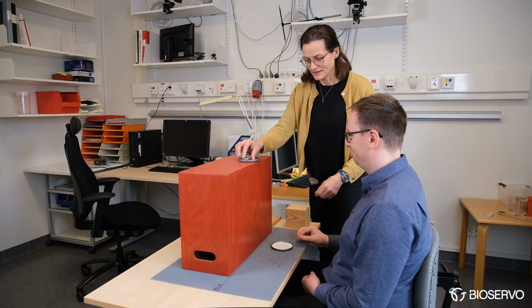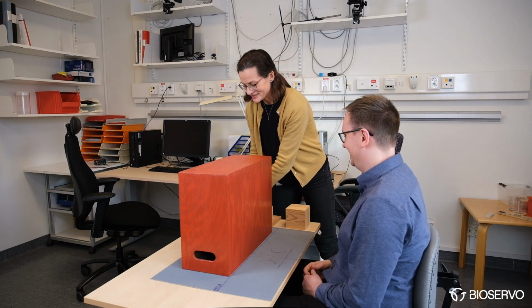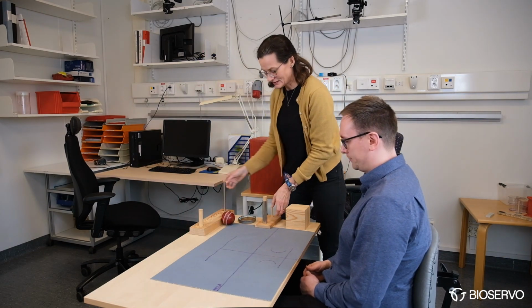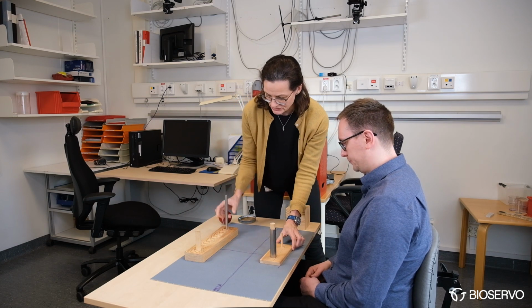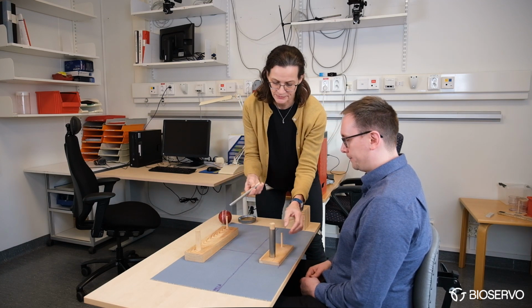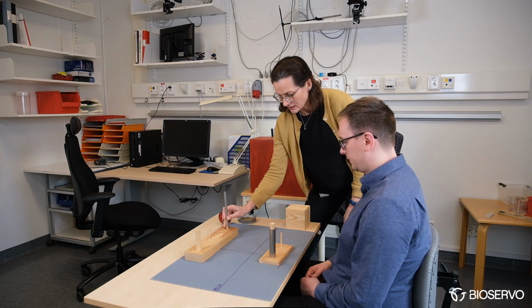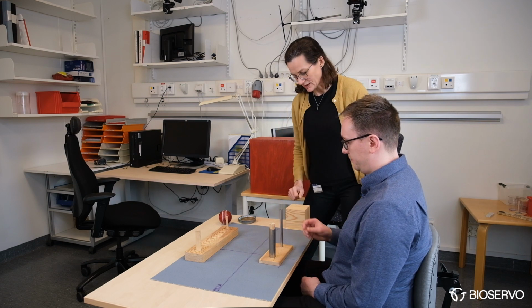And back. So in your case, everything is easy, but it's not usually so when you have difficulty to move. No, of course. And I show the other one here, for example, the different grasp, and we have different sizes of tubes here, and here you take the tube and put it in the other one a little bit further away. So you can try that one also.